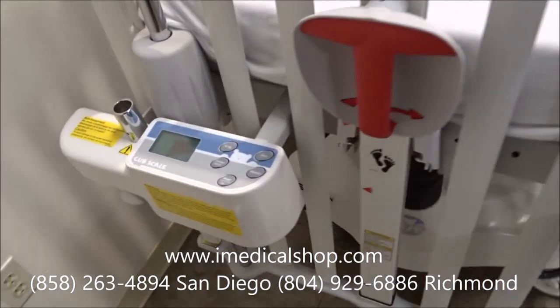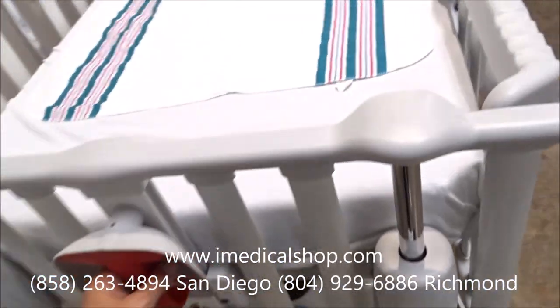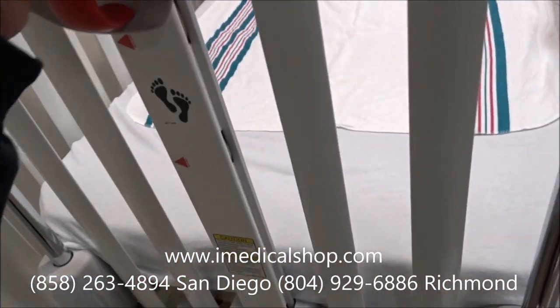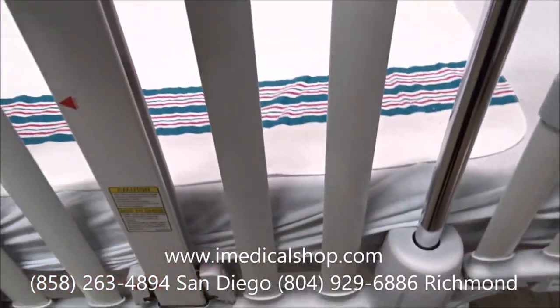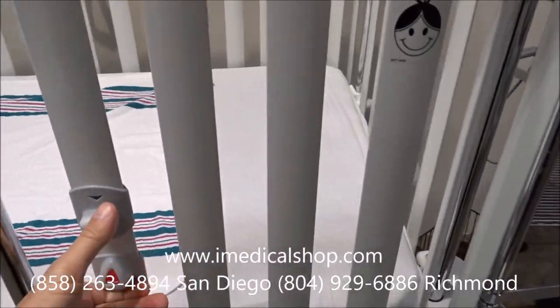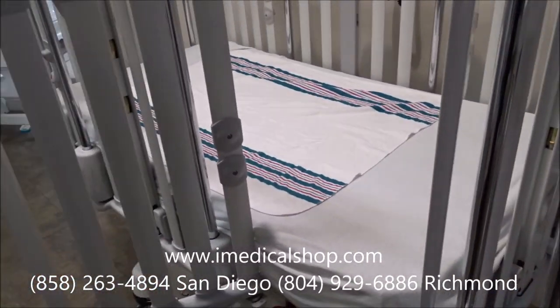Other features, now this is an optional feature, is a scale. This particular unit has it. I'm going to go ahead and just lift these back up again because there's a couple other features here that I want to show you. One of those is that all four corners open. So I can open up all four corners and get easy access to the infant.